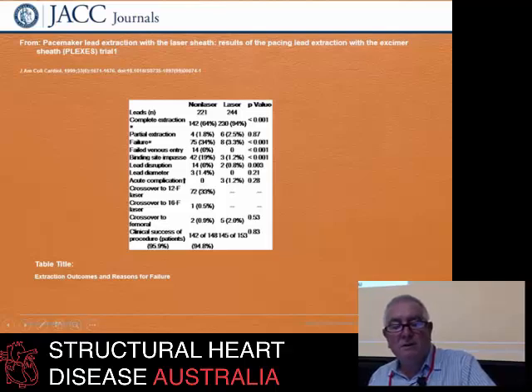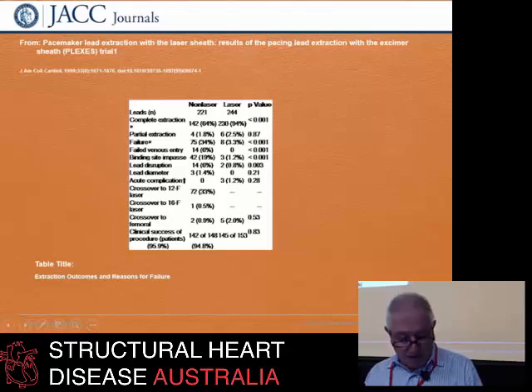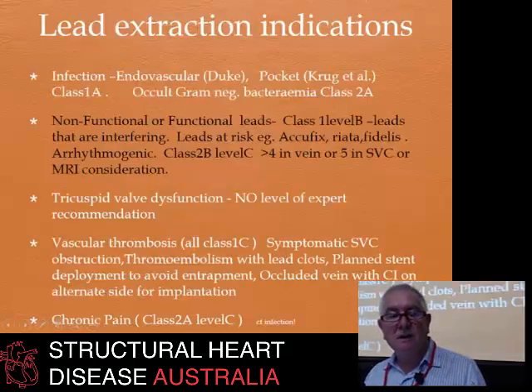There was, however, a slight increase in the risk of acute complications, but that didn't reach statistical significance. So I think it's important, if you're going to undertake this, that you have the complete armamentarium of devices so that you can get a complete result, particularly in infected cases.